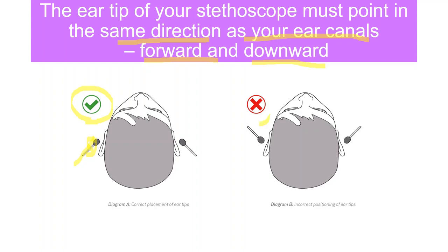This is the right way of placing it: forward and downward, the same direction as your ear canals. That way you can better appreciate the sounds.